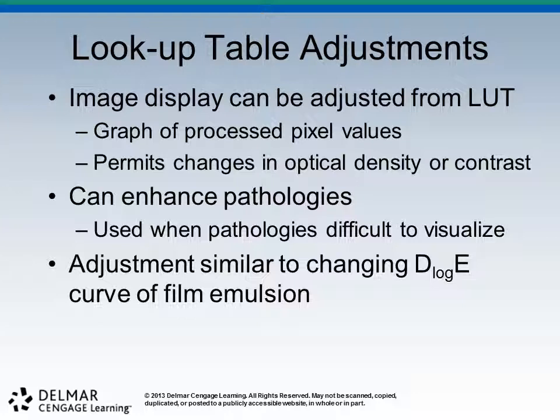I just refer you to Best Buy, to the ultra high definition televisions these days. So film and CR/DR are to the point now where they can capture and express about the same levels of detail, spatial resolution, if we can see it. And now we can use some of these software tools to enhance that pathology. So I guess what I'm saying, in a long roundabout way, is it's possible for us now to visualize things that perhaps we wouldn't have seen before.